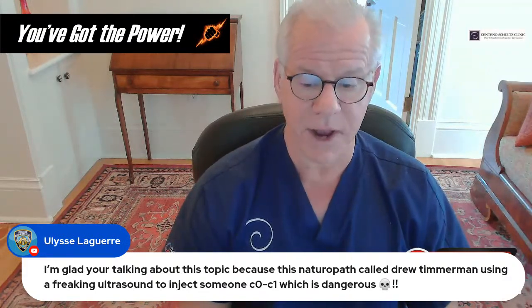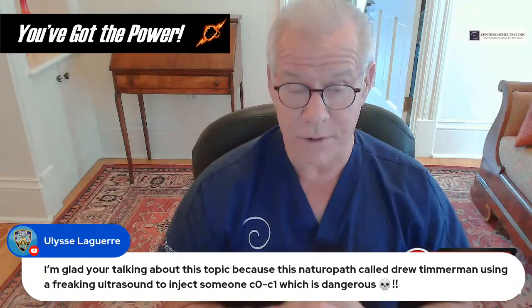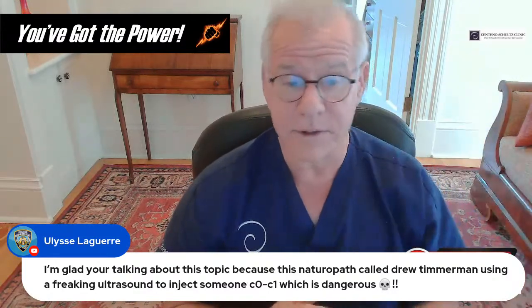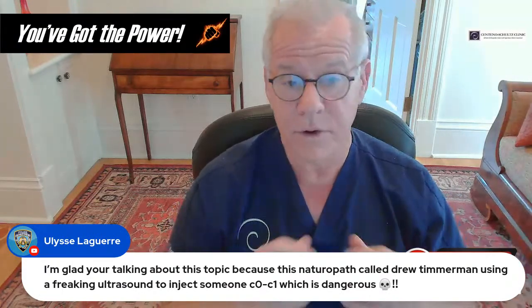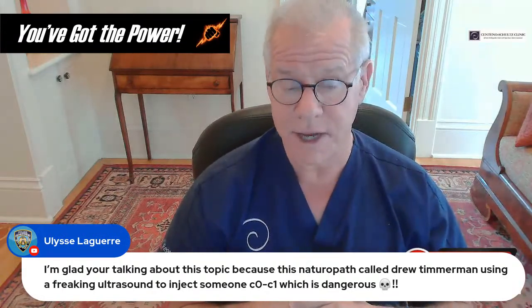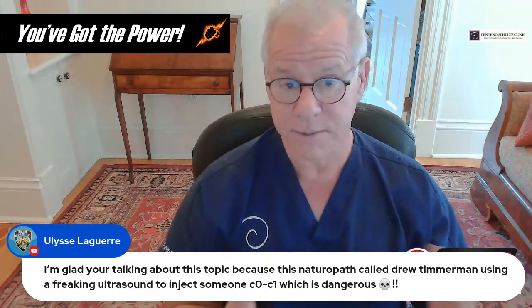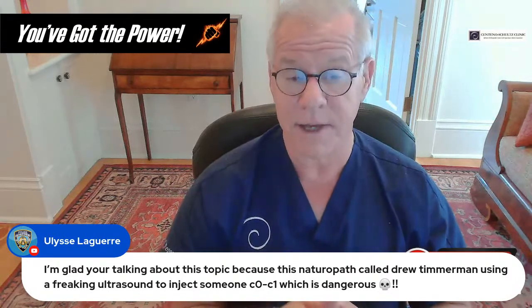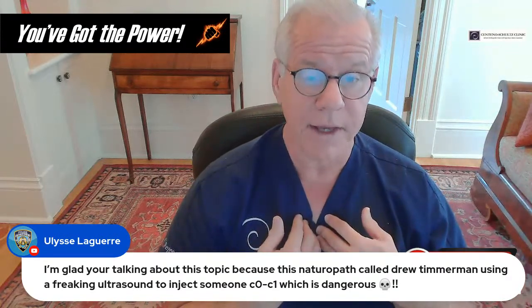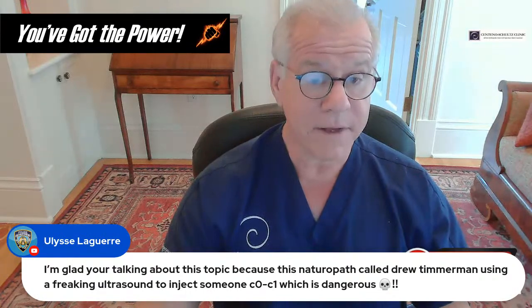You need fluoroscopy with digital subtraction. Listen, we've got lots of ultrasounds in the office. I'd love if I could do that injection competently under ultrasound and feel that it was safe for the patient. I wouldn't have to have a $140,000 C-arm. I could do it with a $35,000 ultrasound machine. I wouldn't have to have a room with lead-lined walls. I wouldn't have to have a $100,000 a year rad tech to run the machine. So it would be fantastic. I would make lots more money if I didn't need digital subtraction angiography with fluoroscopy to do it right. But you do. It's a couple $100,000 more of cost to me to do it that way. Again, I'd love to use a $35,000 ultrasound, but it's not going to make me feel safe about protecting the patient.